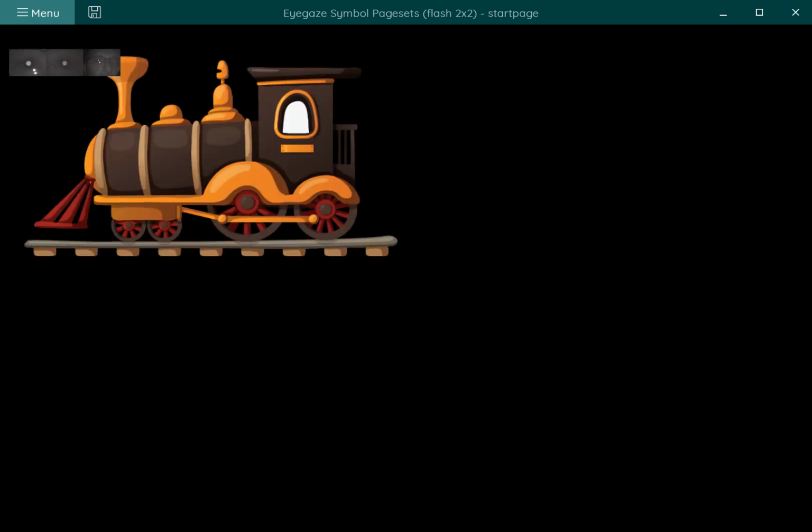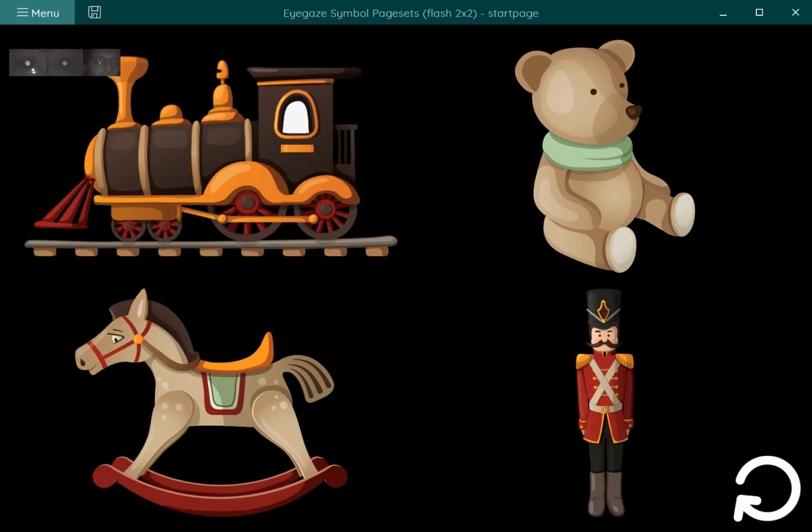Okay, as I'm looking at the screen, what it's going to do is after the activity is done, it has shown me a heat map of where that person is focusing. So you'll notice I was just really focusing around this first toy and I didn't look at these other ones. This allows us to understand and see where the person's attention, where their eyes are pointed for this activity, which can be very helpful for some patient populations.